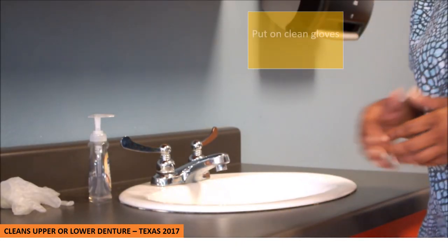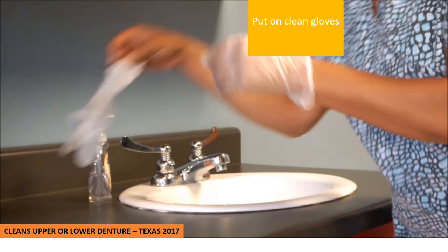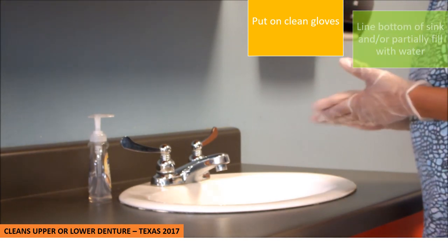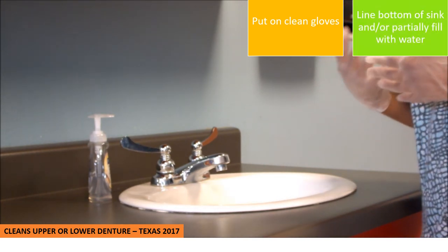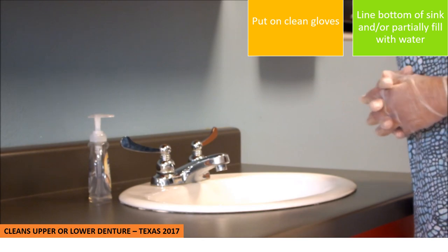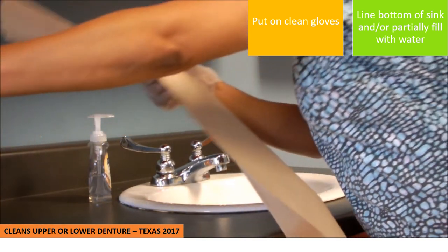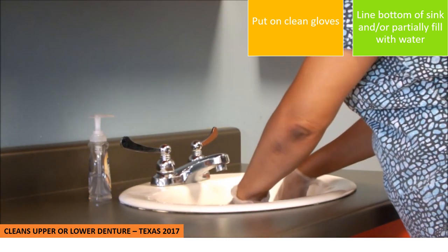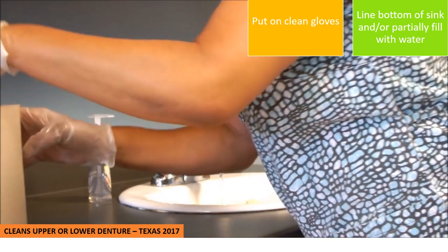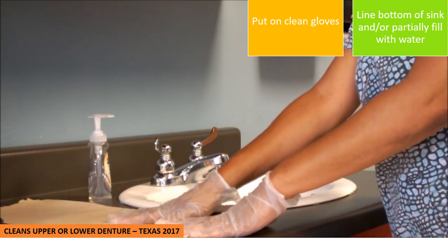First, put on a pair of clean gloves before you handle the dentures. Then you will want to line your sink with either a paper towel, a towel, a washcloth, or fill it halfway with water. What I like to do is go ahead and line my sink with a paper towel and start running the water to get it halfway filled up. I will then take another piece of paper towel to have as my clean barrier.